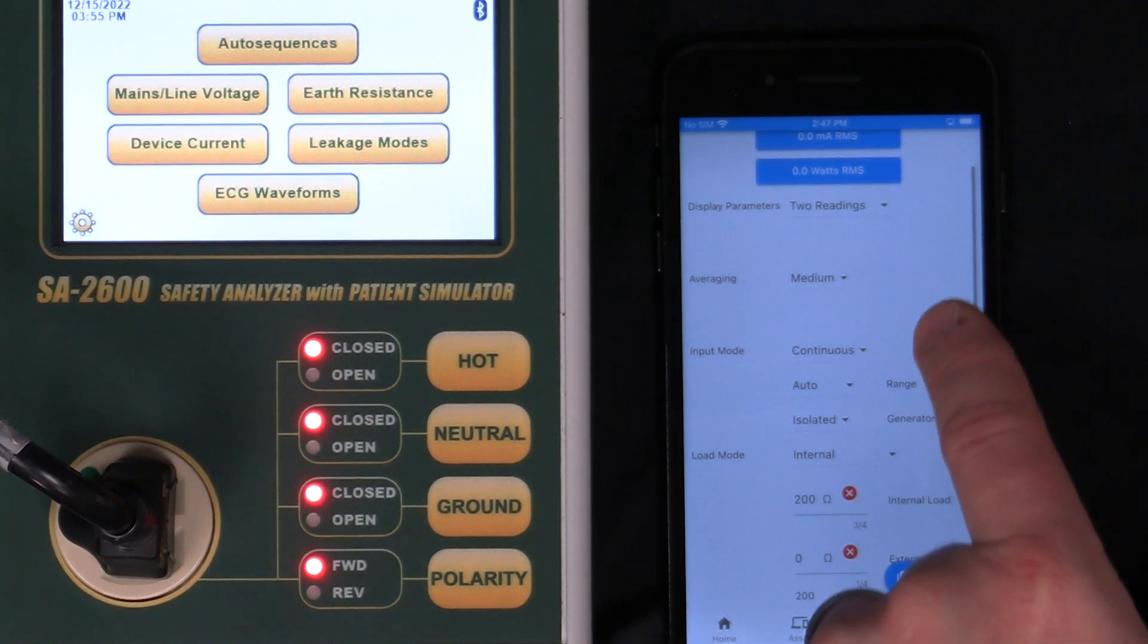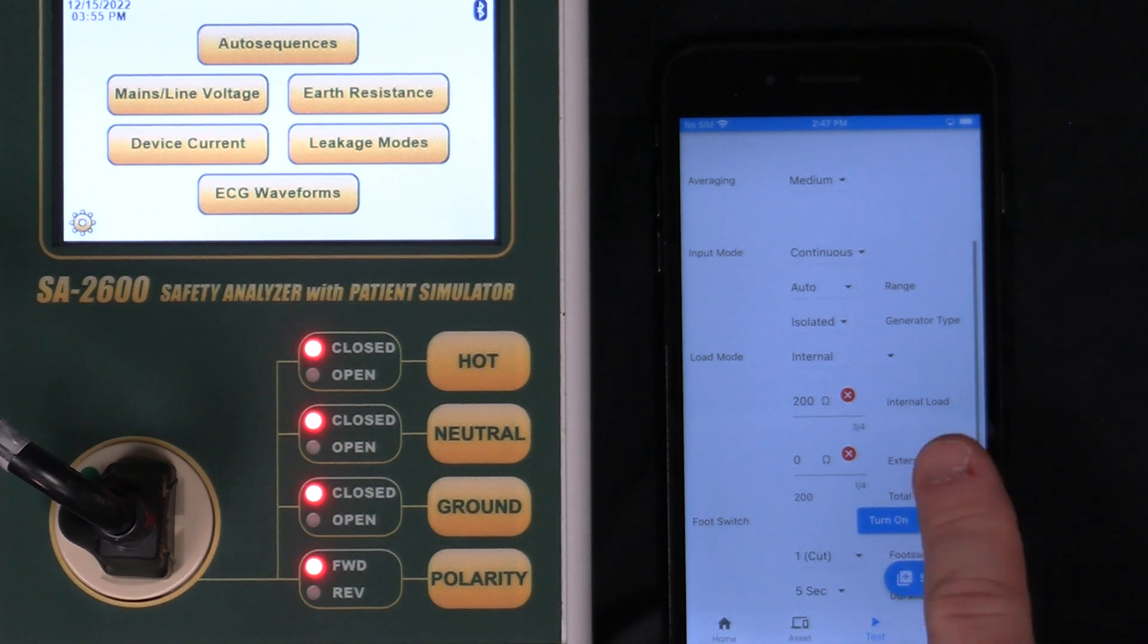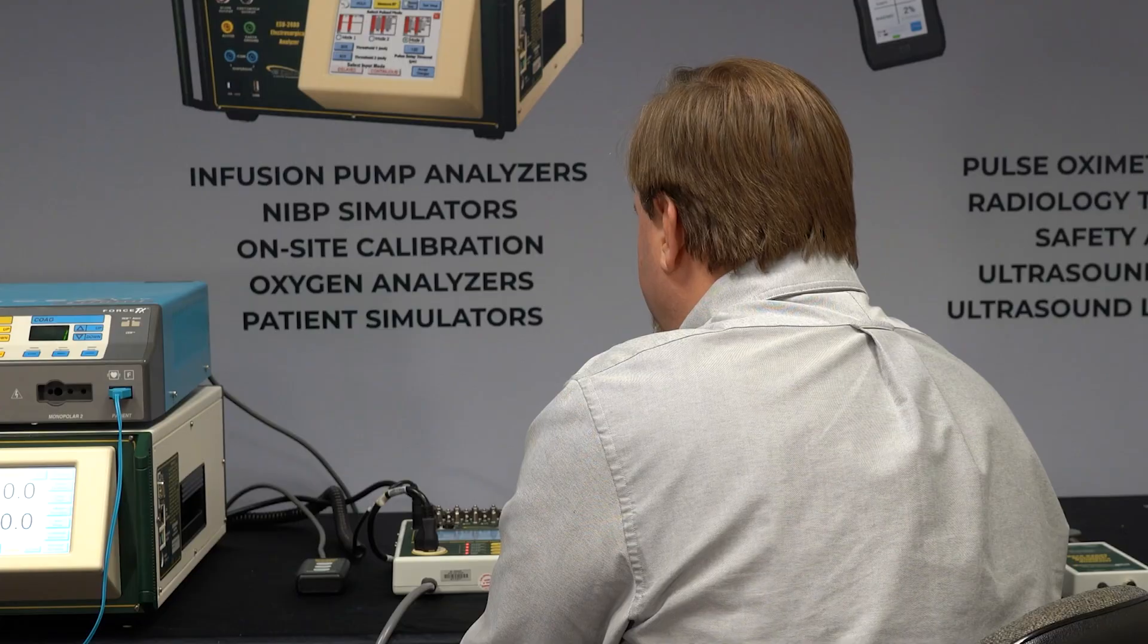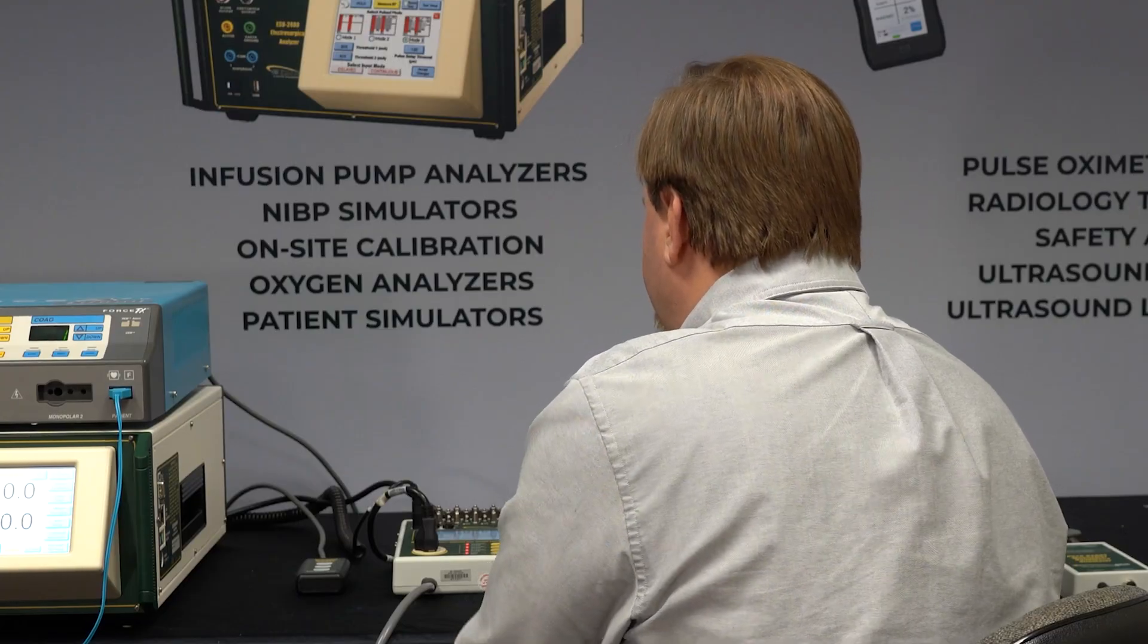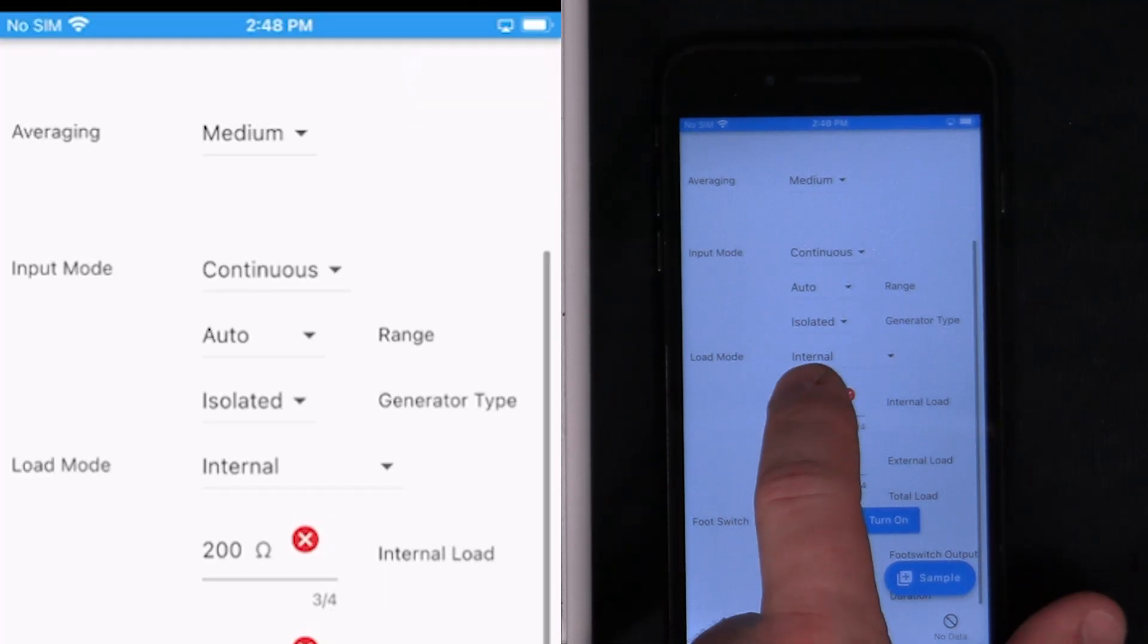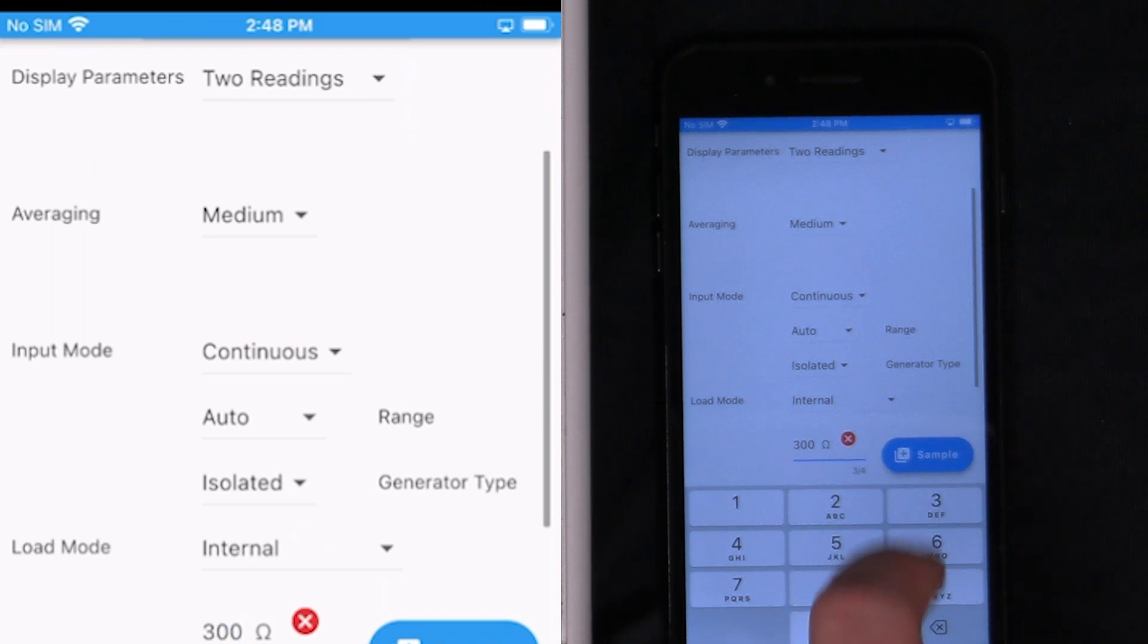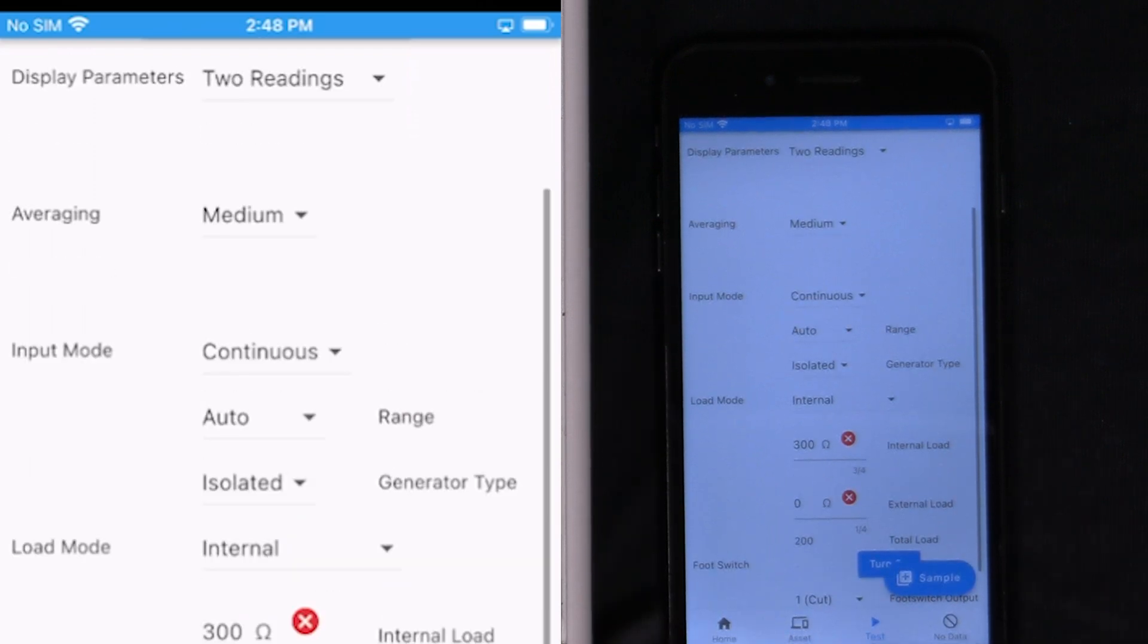We can pick the averaging modes, all of the input modes whether it's continuous or a pulsed waveform, whether it's isolated or ground referenced and what load that we want. Let's say that we want a 300 ohm load. I can clear that here, press 300 and now the ESU 2400 load bank has been updated to 300 ohms.